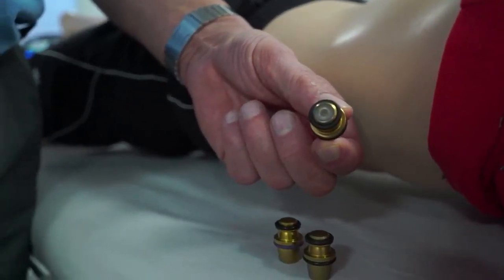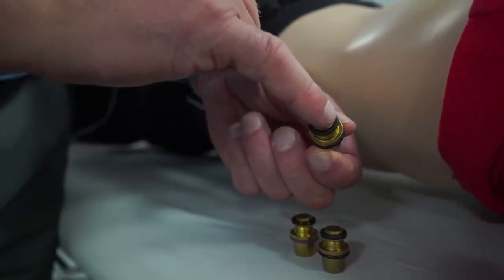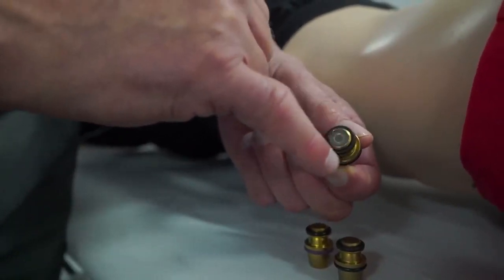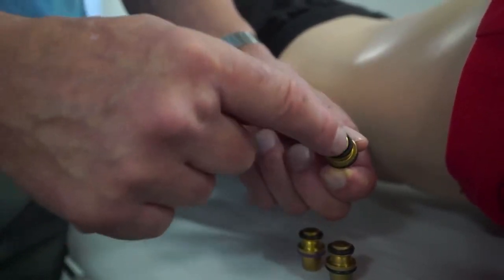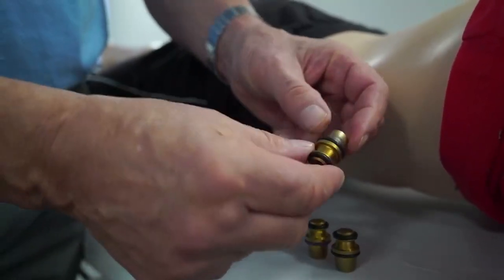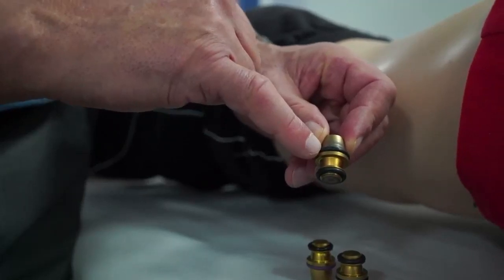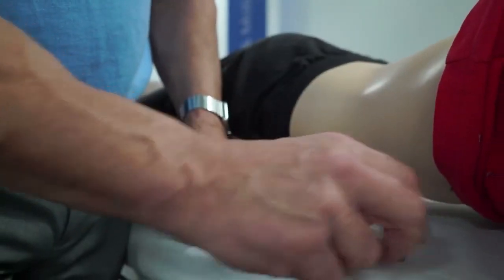You'll see that not only do we have a big indentation here, we've got the effects of the transmitter, the projectile mushrooming against it. And that's been caused by someone putting the wrong O-ring on when they did their service. So this definitely needs changing. So those are the things to watch for.